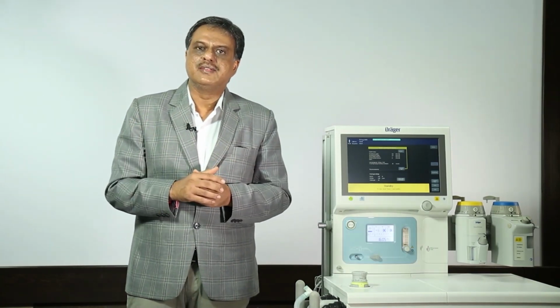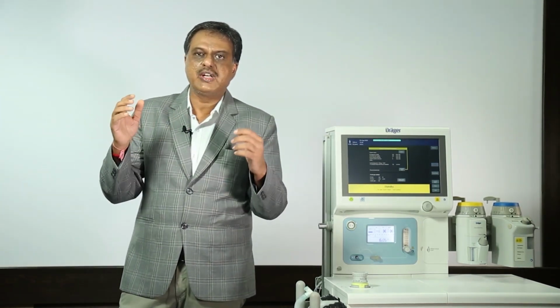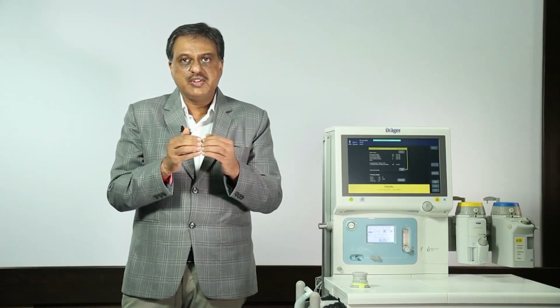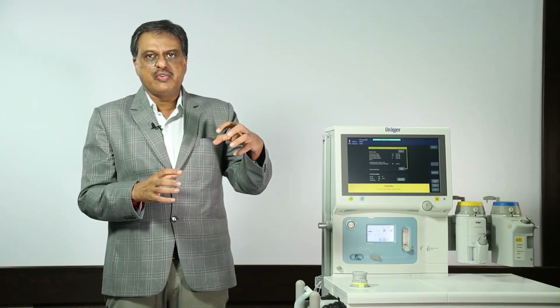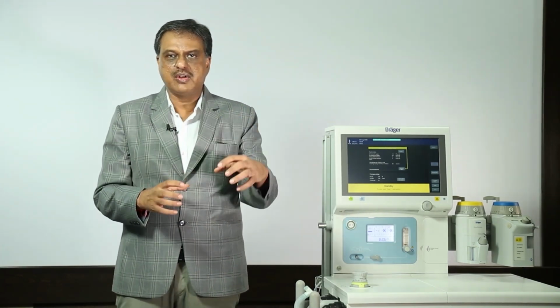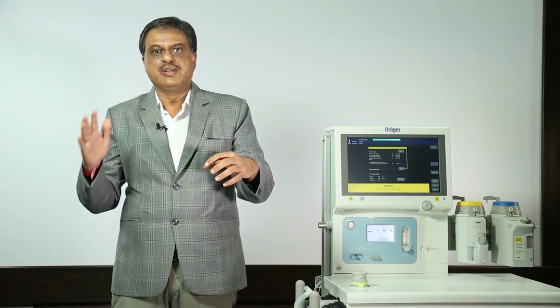cadaveric model of goat. Why do we need to discuss this? Because all patients under general anesthesia develop atelectasis, which ranges from 4 to 21% of the total lung volume, and which contributes to post-operative pulmonary complications. The traditional way of ventilating in the perioperative period may also cause post-operative pulmonary complications as well as ventilator-induced lung injury, VILI. So I am going to demonstrate different ventilatory strategies, lung protective ventilation and lung recruitment one by one.